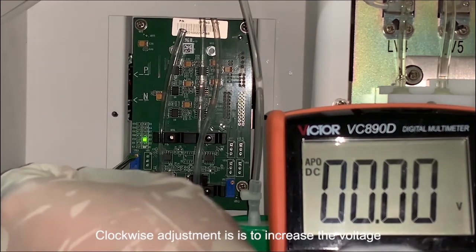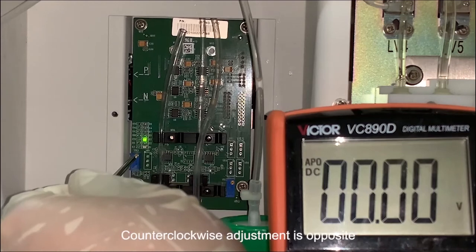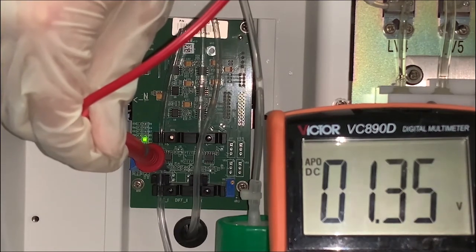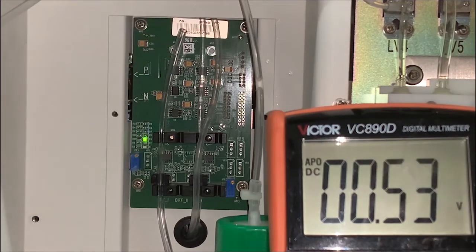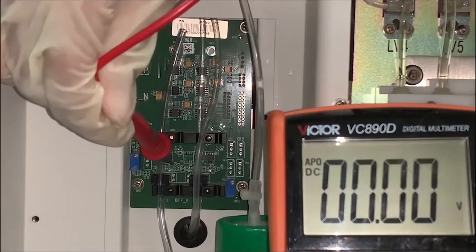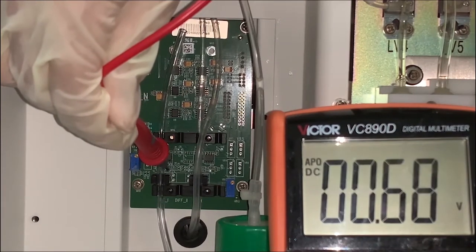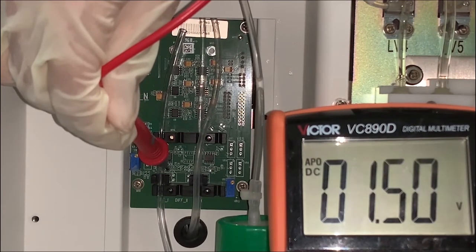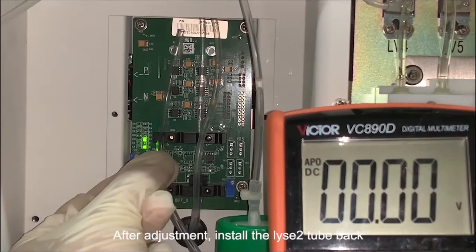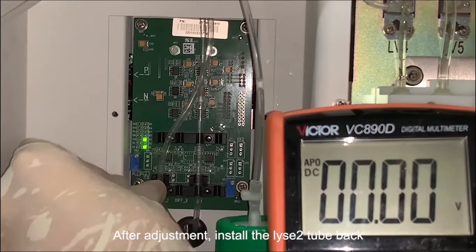Clockwise adjustment increases the voltage; counterclockwise adjustment is the opposite. After adjustment, install the line 2 tube back.